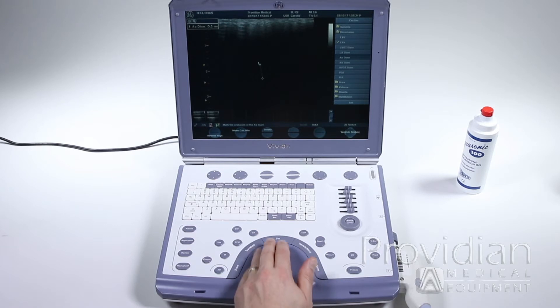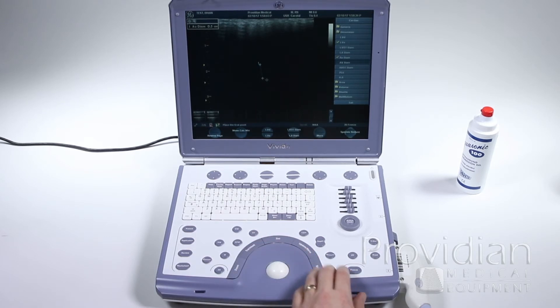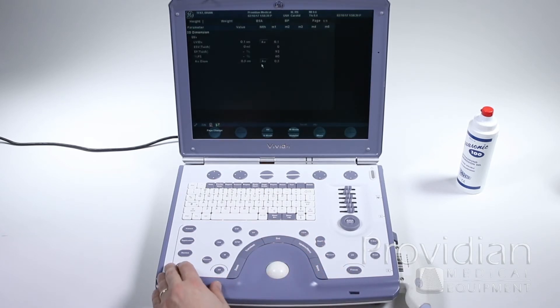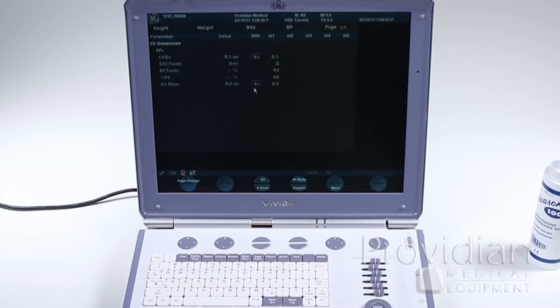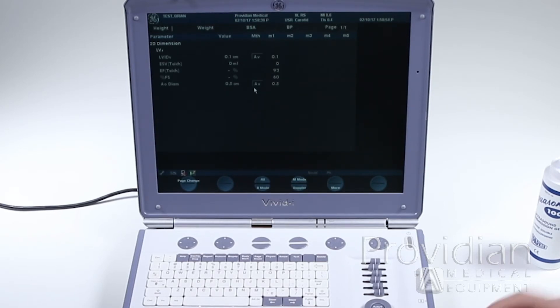When you select that, store and then unfreeze, you can click on the worksheet again and there you have that diameter right there. This is the same on any other ultrasound machine — if you don't use a specific calc or have it assigned to a specific piece of anatomy or calculation, it won't show up in the report. That's just an FYI.